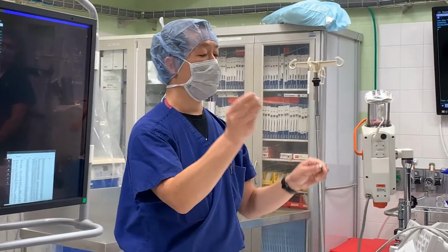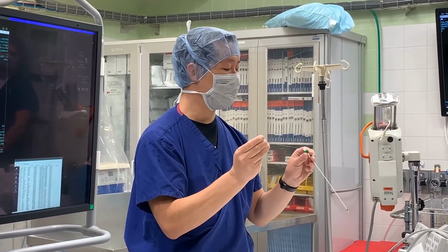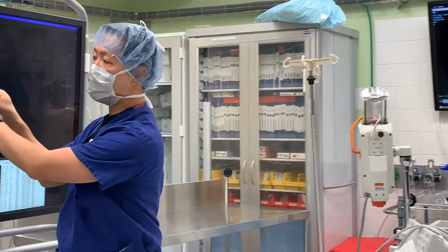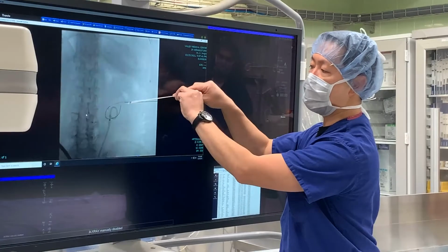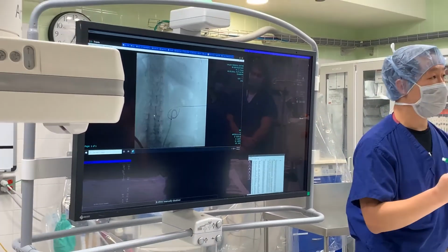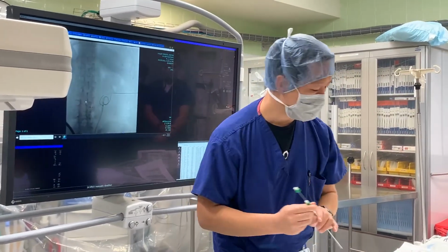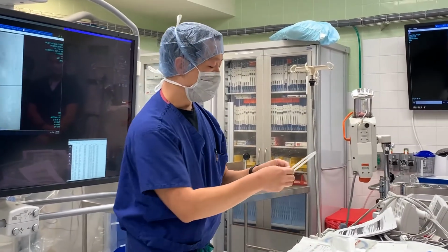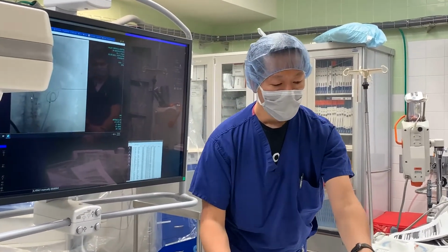This is stiff. It's got a sharp, hard stiffener in it. It cannot make that final turn. And so what we do is that once we get this into the kidney, we start taking this off, and sometimes we then advance the last part over. Okay. This allows us to transition from a less traumatic system to an actual working wire. Okay.